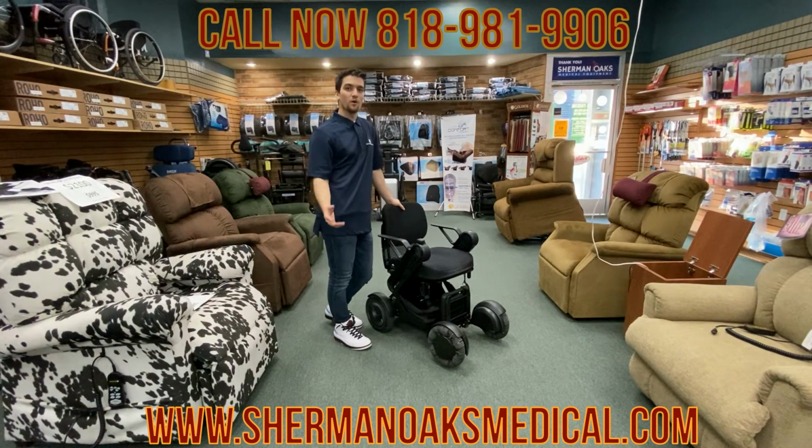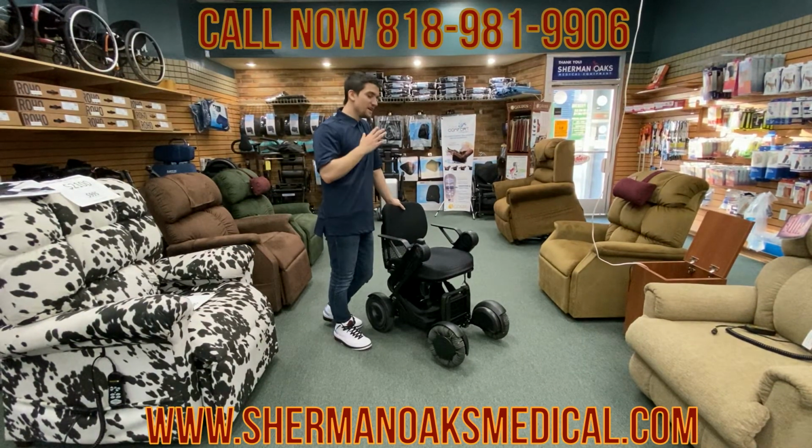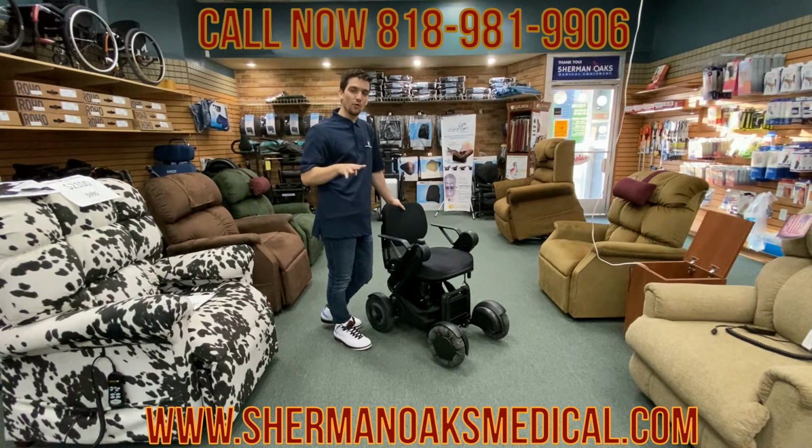The next thing I'm going to go ahead and go over is how to fold the Whill Model Ci. If you count the basket, the Ci has about 4 pieces. Without the basket, you have your 3 heavy pieces. All of them are going to be right around 30 to 40 pounds in piece weight.